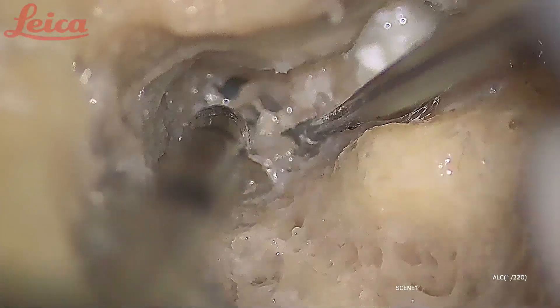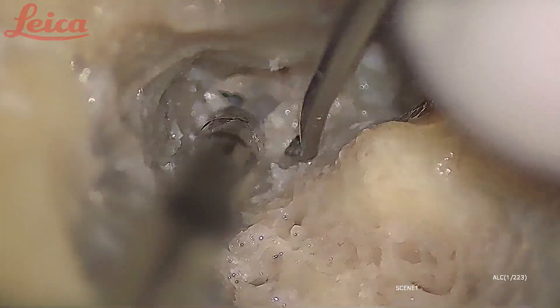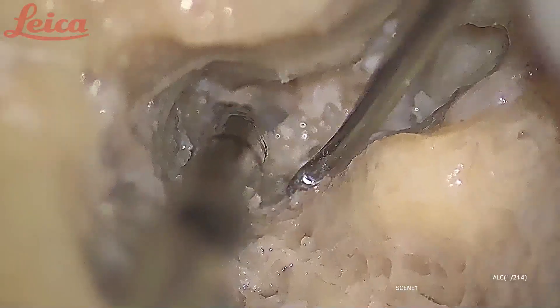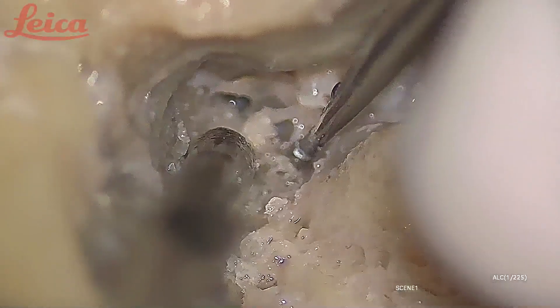Whenever you are drilling in that area you have to be careful — like these cells, if you are clearing in cases of cholesteatoma surgery. The area here is safe, you can clear it, but the area near the suction is not safe because that houses the first genu.